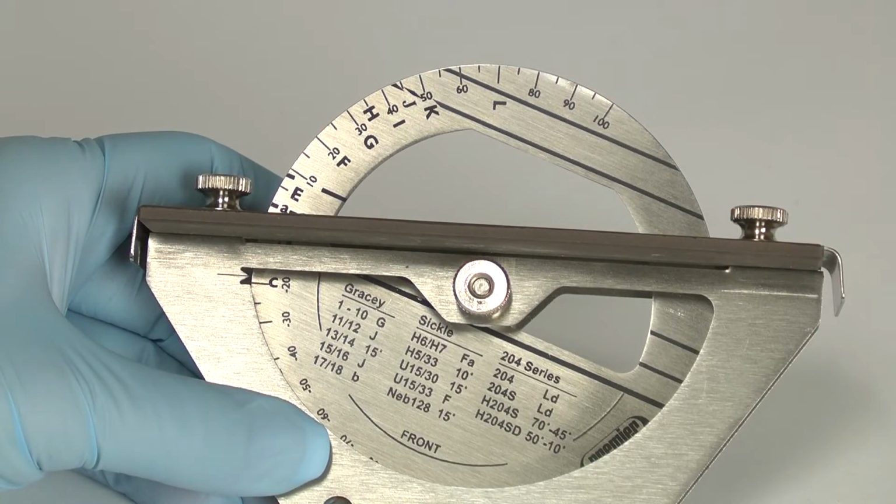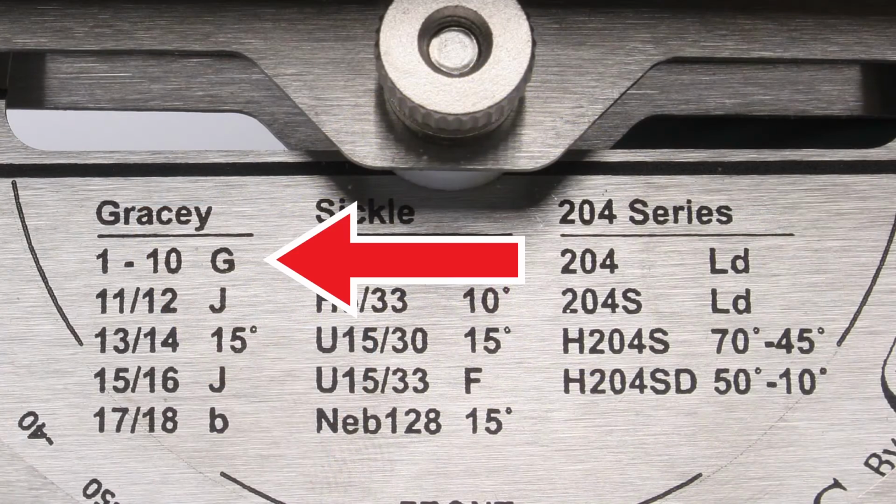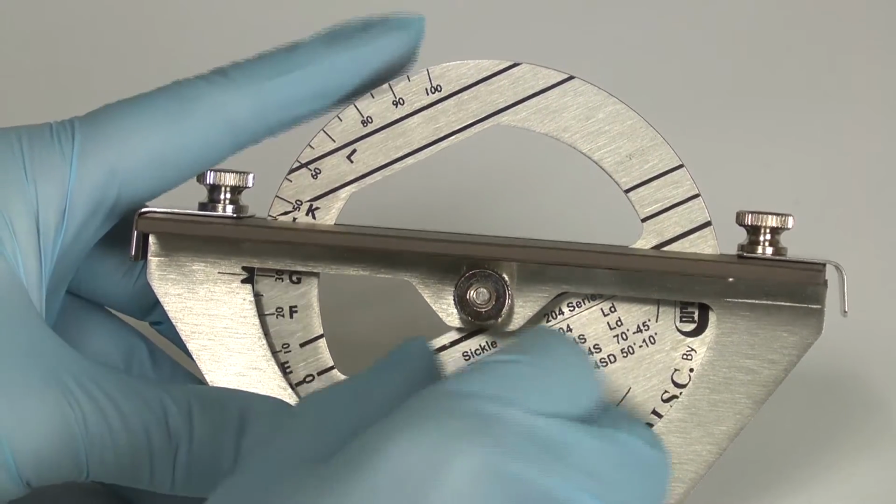The proper setting to sharpen the Gracey 1-2 curette on the disc sharpener is the uppercase G. Rotate the wheel so that the G setting will line up with the indicator line. Tighten the screw.